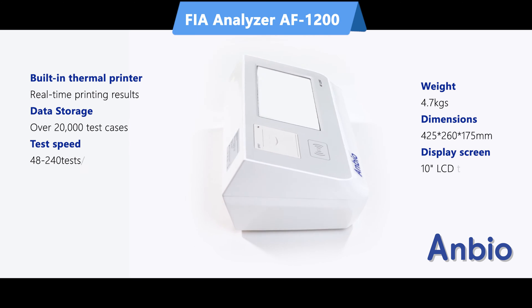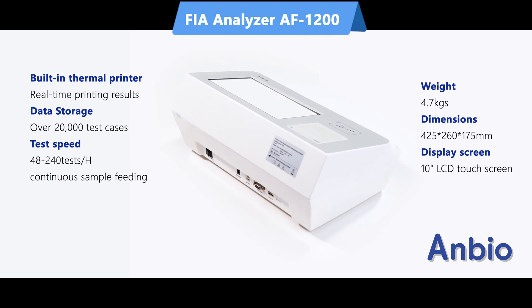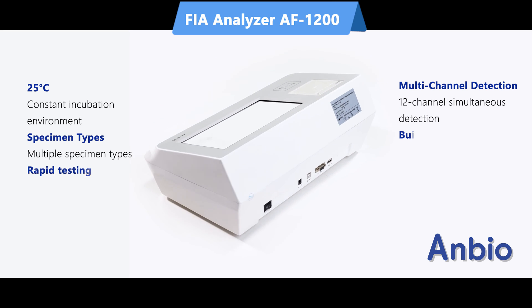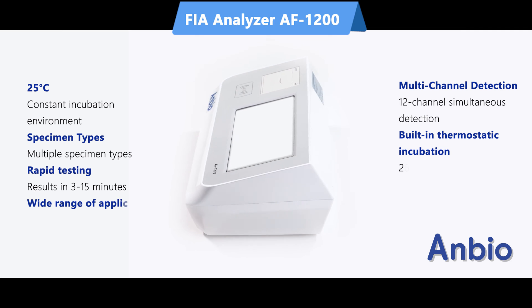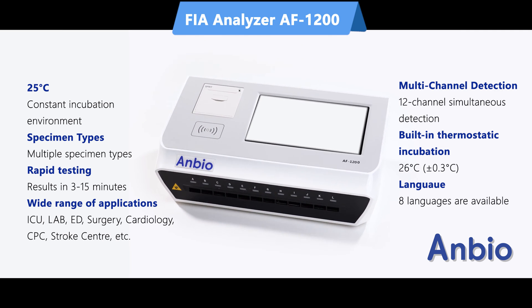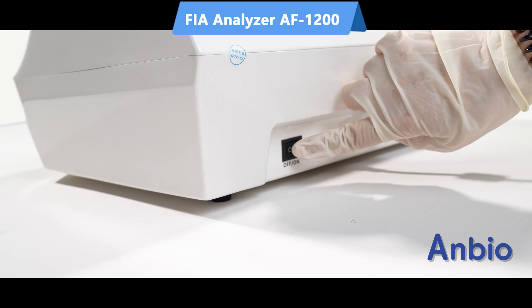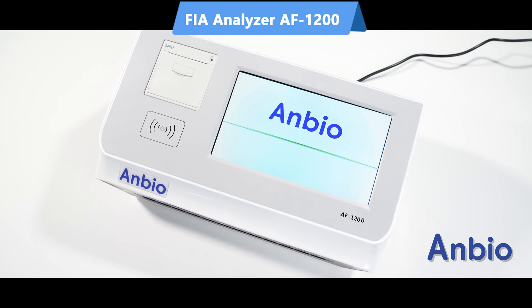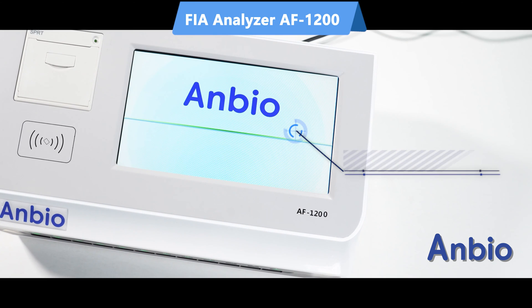The AF1200 Immunofluorescence Analyzer is compact and lightweight at just 4.7 kilograms, with dimensions measuring 425 mm in length, 260 mm in width, and 175 mm in height, featuring a vibrant 10-inch color touchscreen for intuitive navigation.